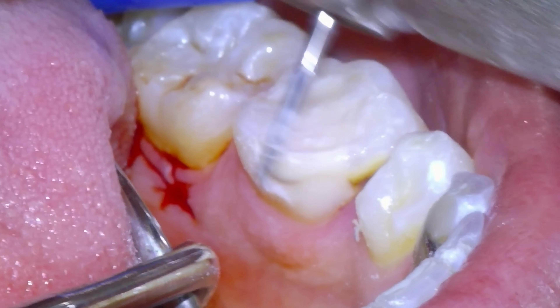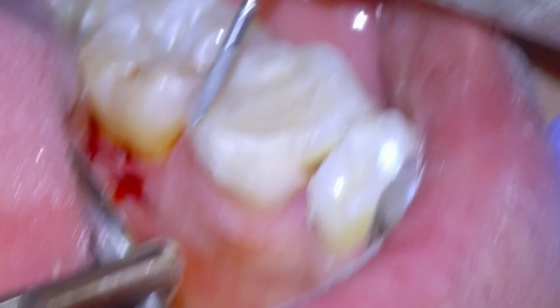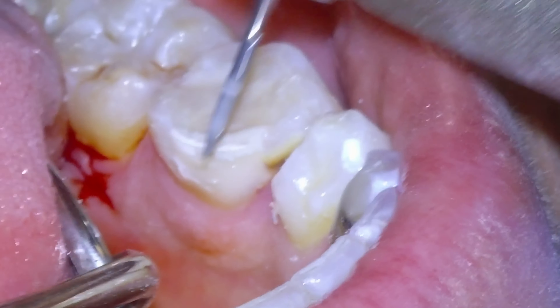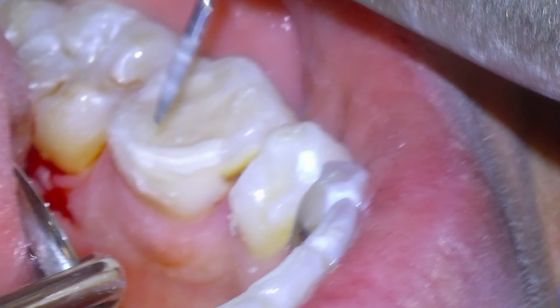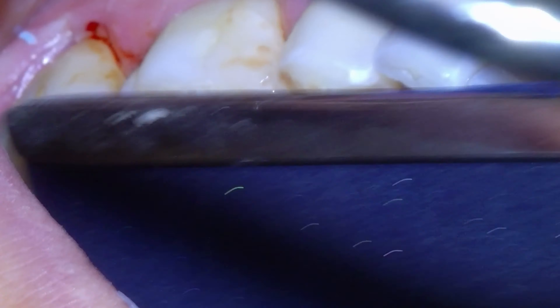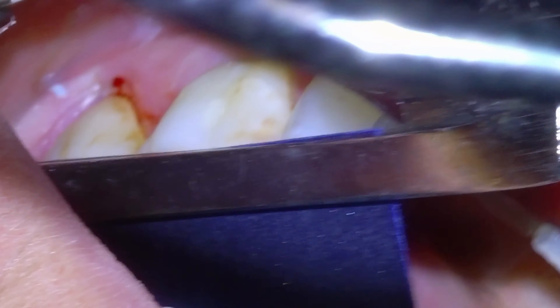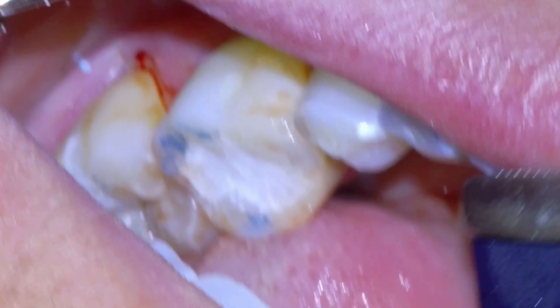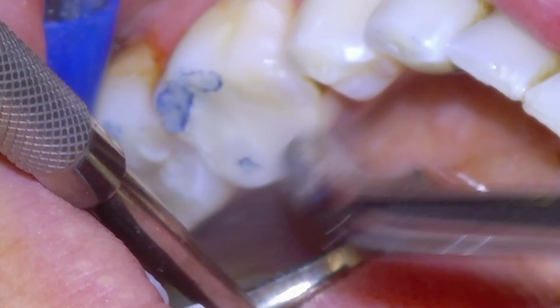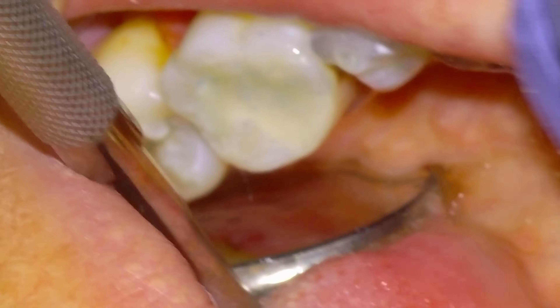You can see there's maybe a little bit of decalcification on the mesial aspect, but the bitewing did not show anything significant, so that's not going to be an issue. The filling is pretty much shaped the way we want it, so we're going to check the bite for the first time. I'll have the patient bite down really lightly and slide around — no contact — then bite down a little harder and grind — no contact on the filling. Bite down as hard as you can and grind as hard as you can — still no contact on the filling.